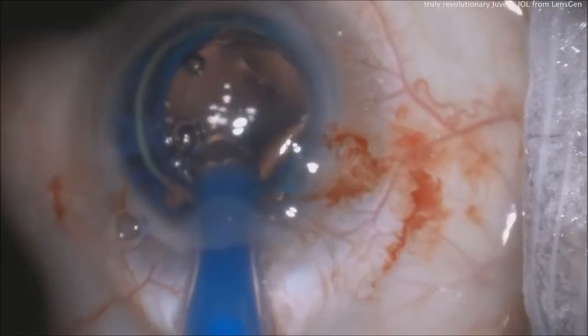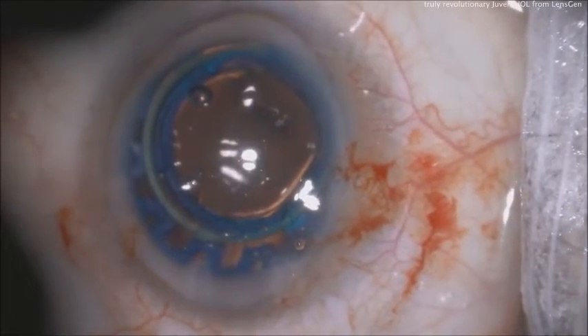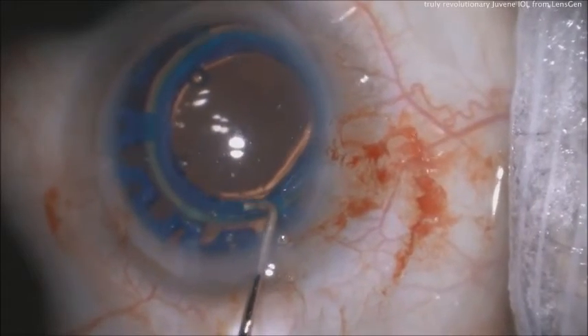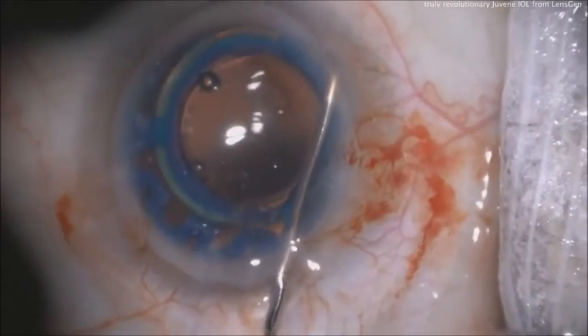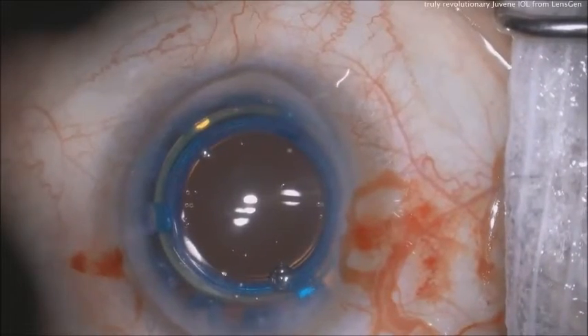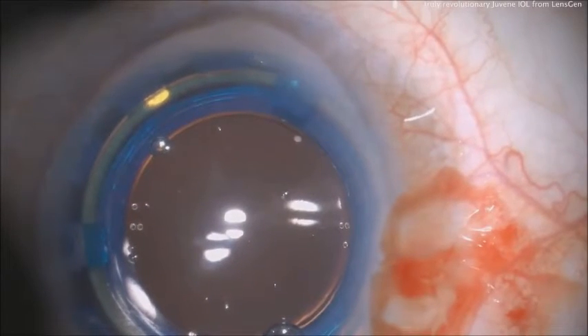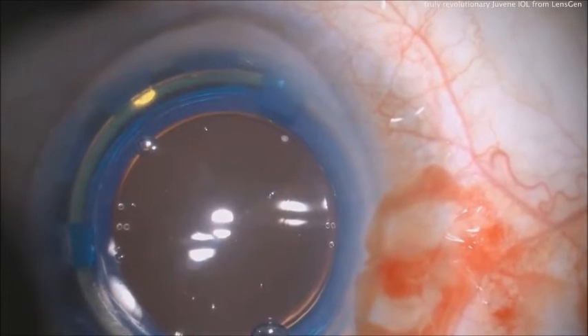This particular case has a toric lens marking, which you'll see. You can also have a toric correction if need be. It is tapped underneath those three tabs and we go from there. Post-op routine is totally regular — normal antibiotics, steroid, NSAID. You can see those are the toric lens marks on the surface of the front lens.